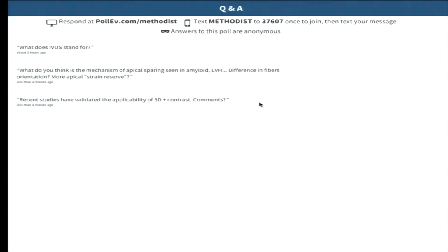By doing what we do for almost everything in the lab, and that is look at multiple parameters, and decide, especially when there's discordance, which one may be wrong and why. So you're not stuck with choosing between those two. That's not an uncommon situation. Remember, TAPSE can be regional. It doesn't have to represent the whole lateral wall. The base may be preserved. Half or more of the right ventricle may be abnormal, and it can be abnormal for that reason.